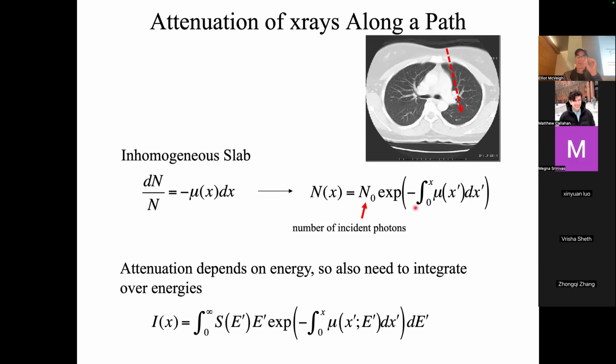Basically, the linear attenuation coefficient, as I move through here, will change as I'm going along the path, right? So if I'm in lung, the linear attenuation coefficient for that small cross-section of that path is very low. And then when I hit a vessel, because it's got contrast in it, boom, it gets very high, right? A lot of X-rays get dumped in there. And then as I come out here, it gets low again, and then I hit bone, then I hit muscle and fat all the way through.